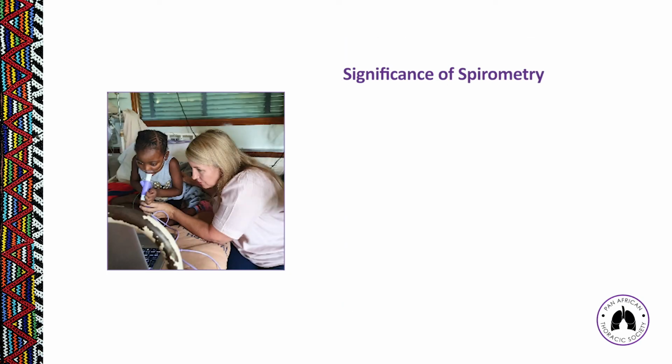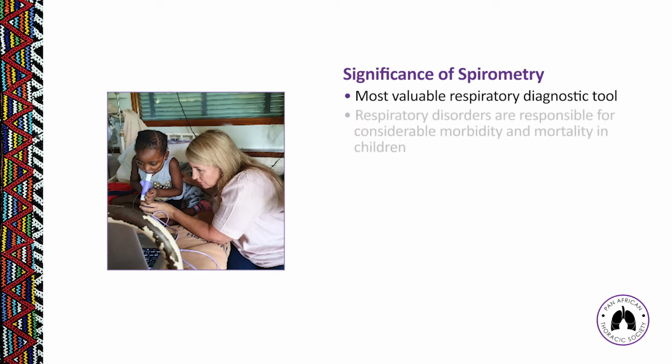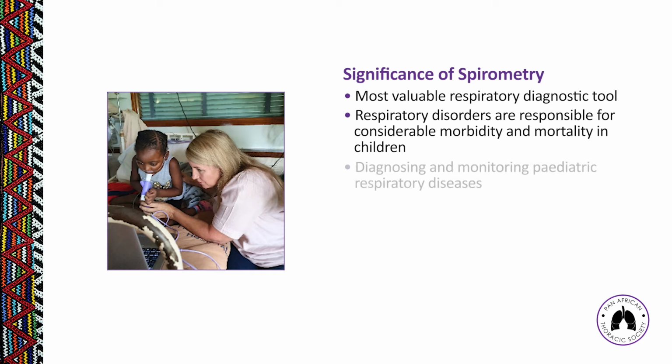So in terms of the significance of spirometry, today a spirometer is the most valuable respiratory diagnostic tool that we have available to look at respiratory health. So respiratory disorders are responsible for considerable morbidity and mortality in children. Spirometry is a very useful investigation for diagnosing and monitoring a variety of pediatric respiratory diseases, but it is currently underused by primary care physicians and pediatricians treating children with respiratory disease.